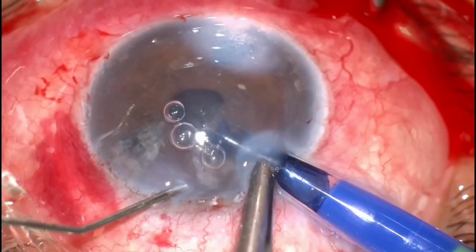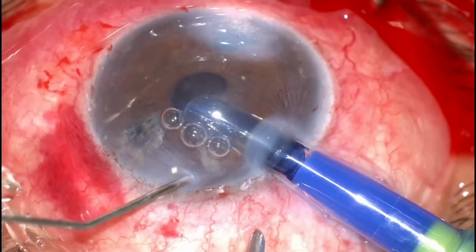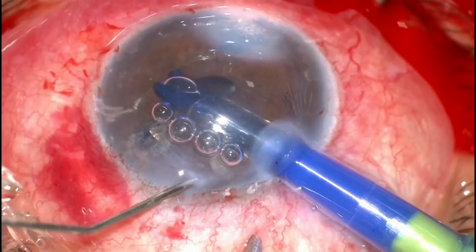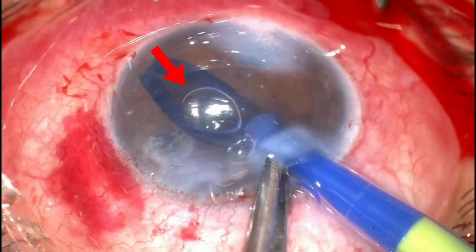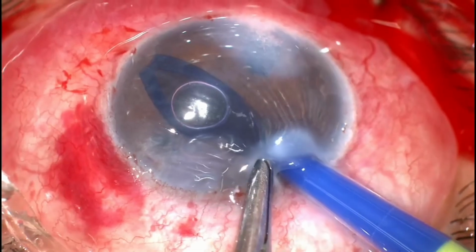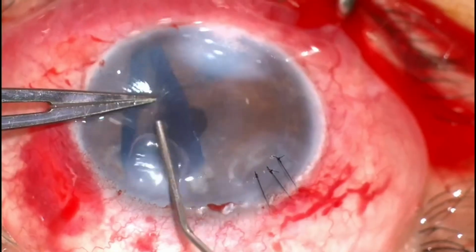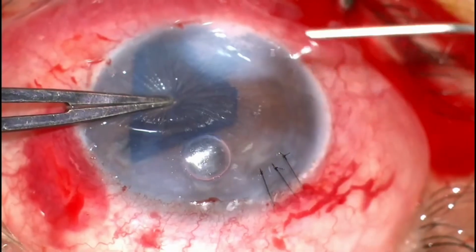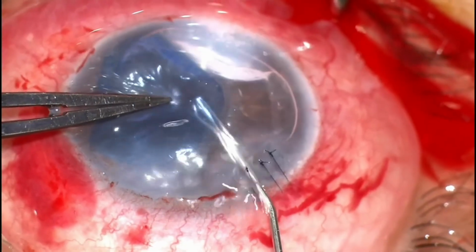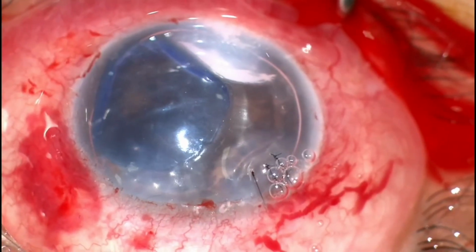And this time it goes in easily, and as you can see, that small air bubble which is in the middle of the graft actually helps me to open up the graft much easier. So once the graft is in and you've identified the scroll, you try to open it up and then you put in air inside. And here we try to pull the PDEK graft to the center to center it.